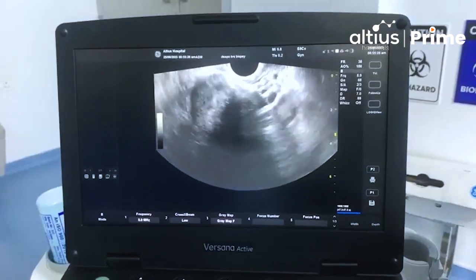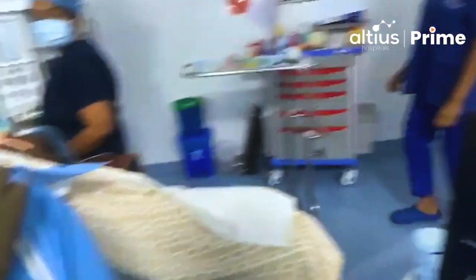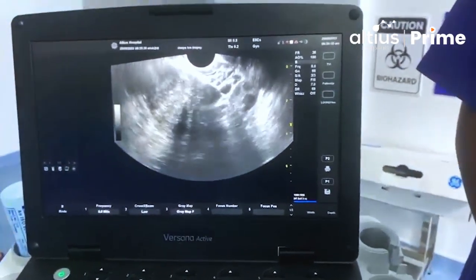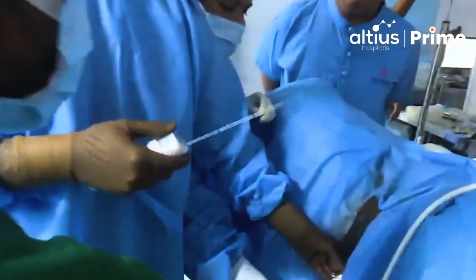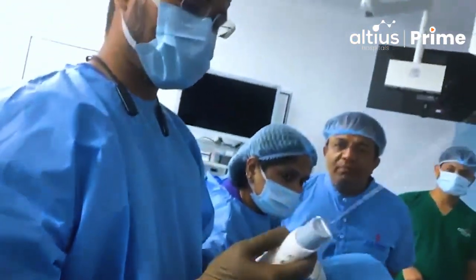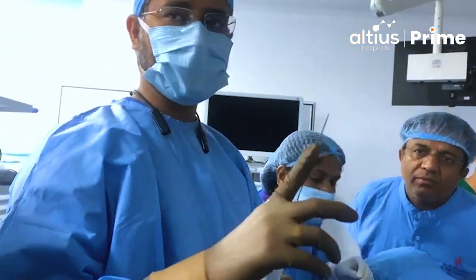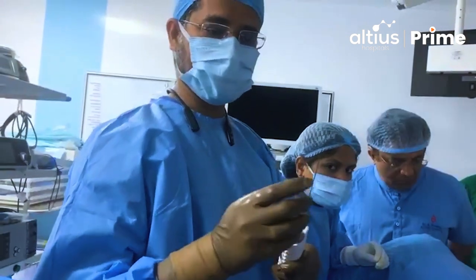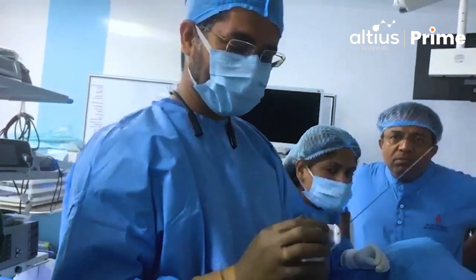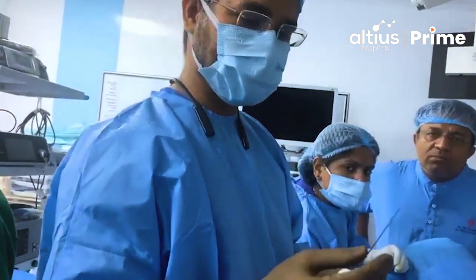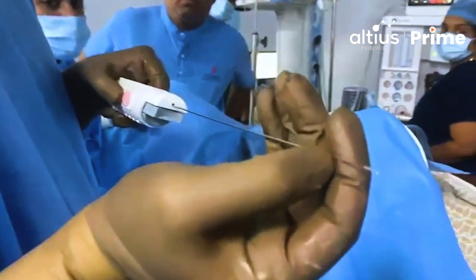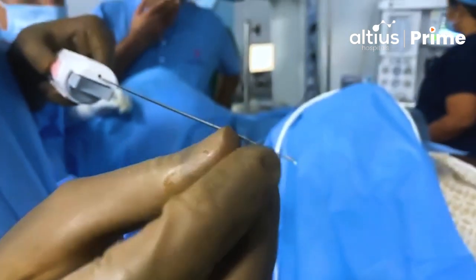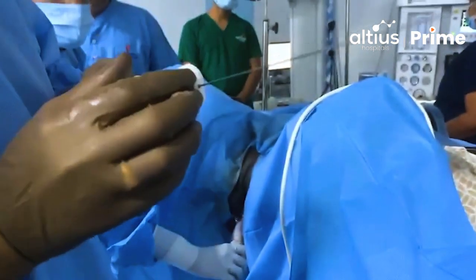After identifying the lesion, one has to park the probe appropriately in the anterior or posterior fornix to obtain a sample. This is the true-cut biopsy gun we are using. As mentioned, this is a long needle — 20 centimeters in length, 18 gauge inner size. We can see there is a notch here; this notch measures 2 centimeters, and we will be obtaining the sample in this notch.